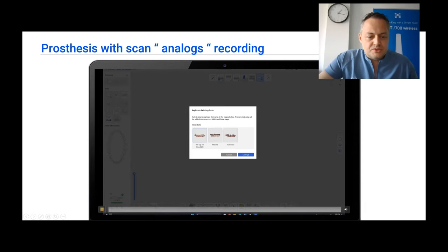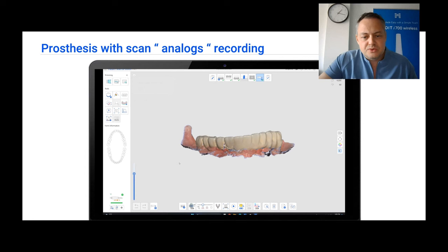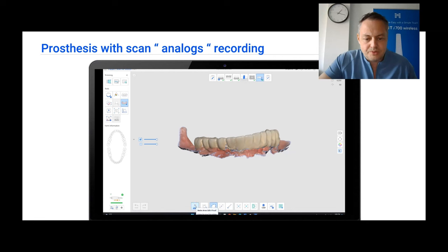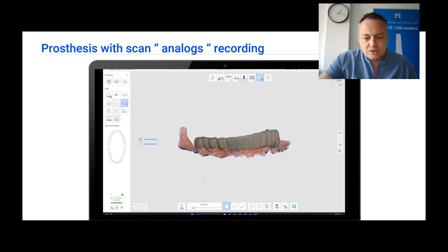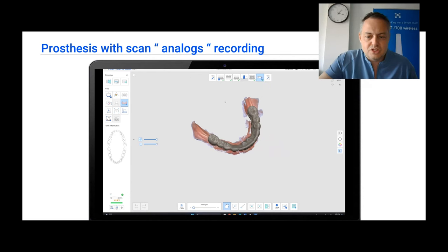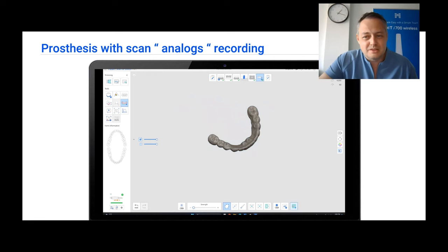We are going to scan the prosthesis with the scan analogs on its interior. To do this, first we are going to remove all the gingiva using Smart Data Cleaning. We just go and deselect the strength. We go in the lock option and we are just going to lock the teeth. Now, because the teeth are locked and cannot be deleted, we get outside the locking stage and just select everything. Because we select everything but the teeth are locked, only the gingiva will be selectable. In this way, we have just removed all the gingiva.